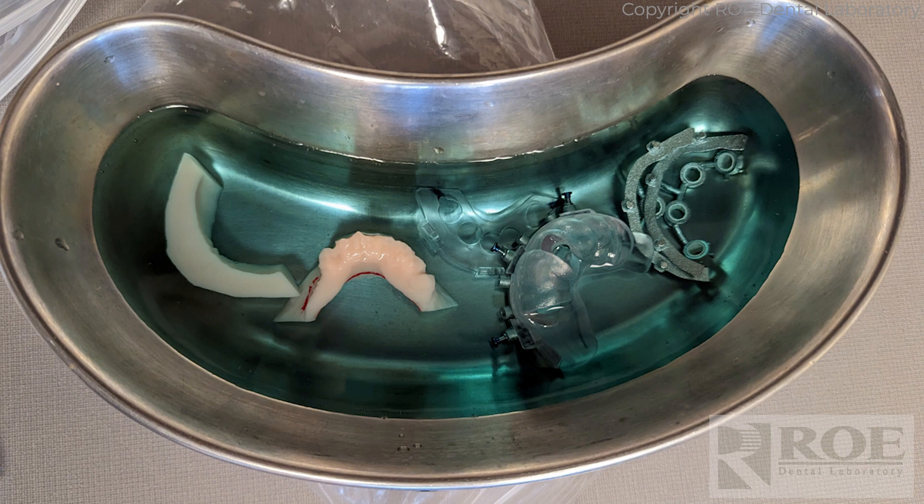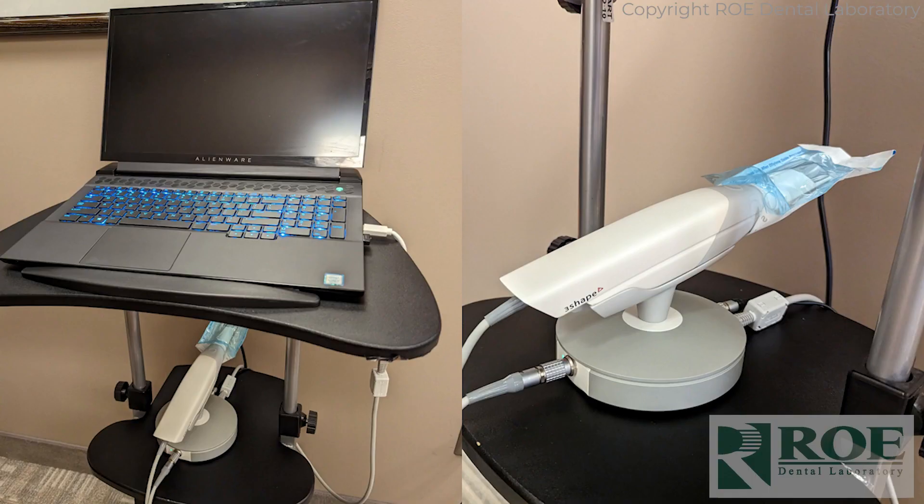CombiGuide is cold sterilized — just a bowl, don't put it in the autoclave, it's plastic. That's about 20 minutes before surgery. Get the scanner warmed up and ready to go; you don't want to wait for it in the middle of surgery. In this particular case, this is the 3Shape Trios 4 scanner.